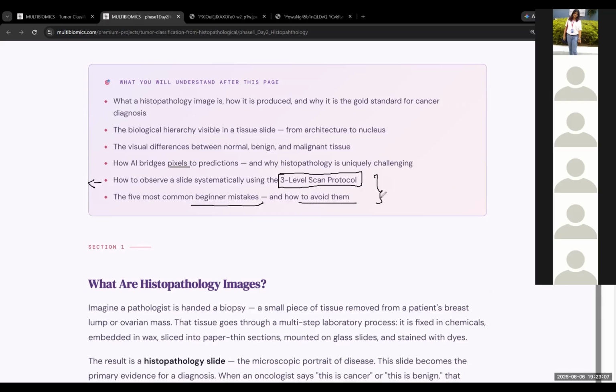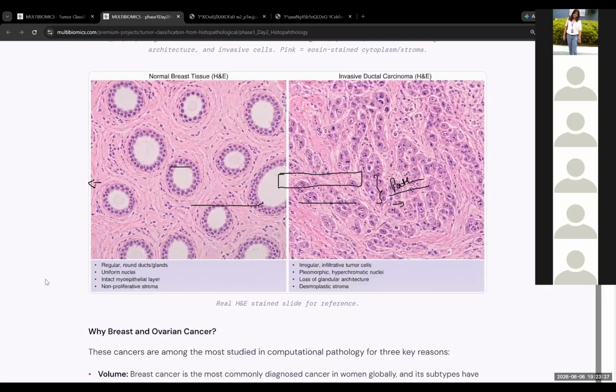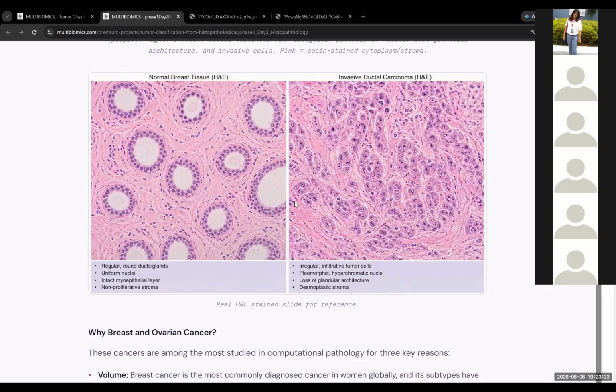Now you know, for all these steps, a pathologist goes through years of training, only then are his eyes trained, and it is not so simple. I just showed you an ultra magnified and AI generated image over here. But for the real histopathological image, only a trained and skilled pathologist can infer. It's not so easy, understand?